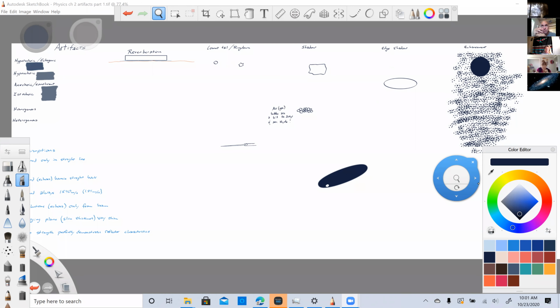Well, they're not real generally, or they might be real something, it's just misplaced. Not seen on the image. So yeah, you could have an artifact of not seeing something when you really should be seeing something. Incorrect shape or size. Yep, that's refraction of sound, speed differences of sound. Incorrect position. Something's placed not quite in the right spot on our screen. That happens as well. And incorrect brightness, so too echogenic, too hypoechoic for what the tissue should be showing.